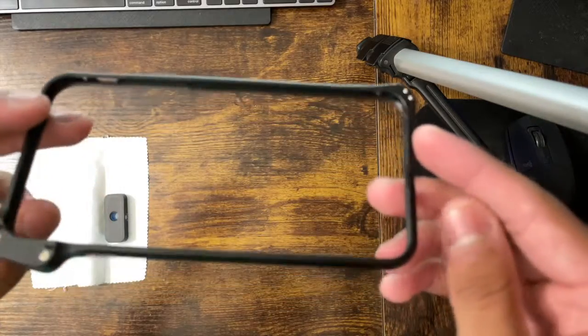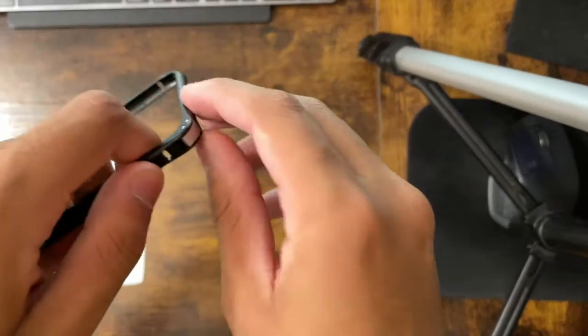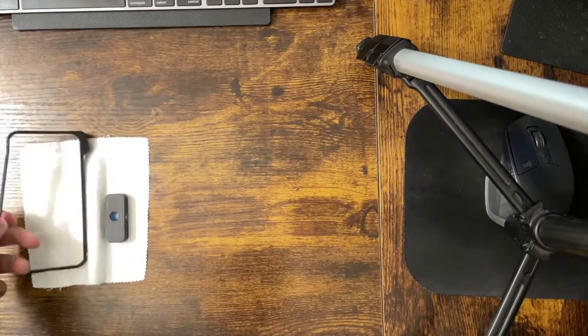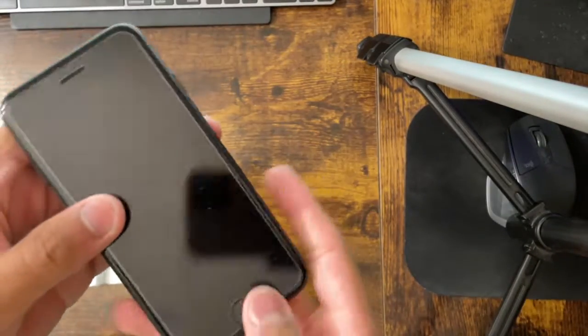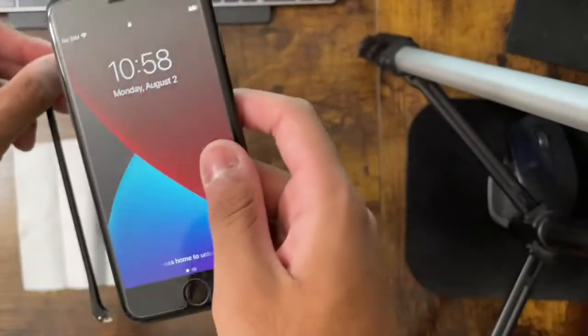Here is the actual casing that is going to go on our phone. You will place the retinal camera on that, and we'll show you how to place this onto the actual iPhone in a second. And as you can see, it clips out so you can place the iPhone in. Here we have the actual iPhone. The iPhone 7 is the only model that'll work for this system currently.